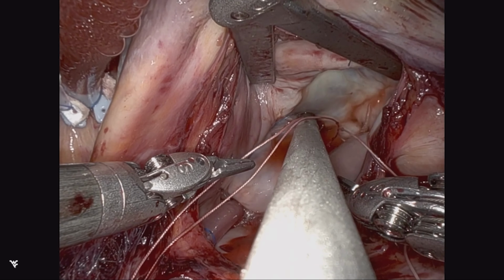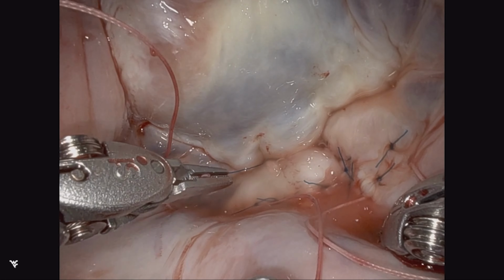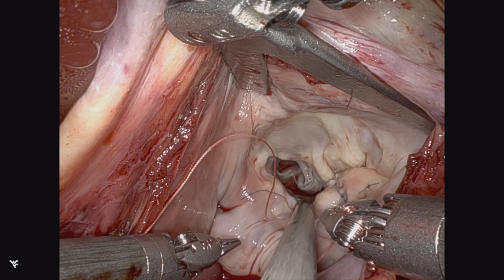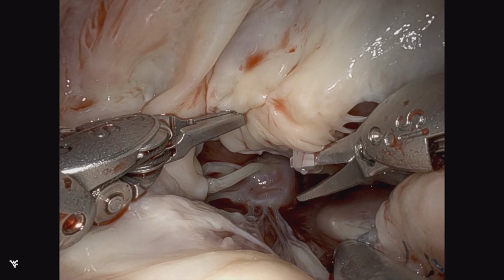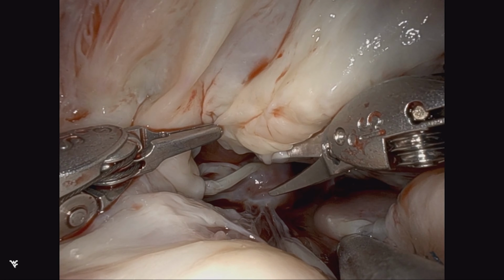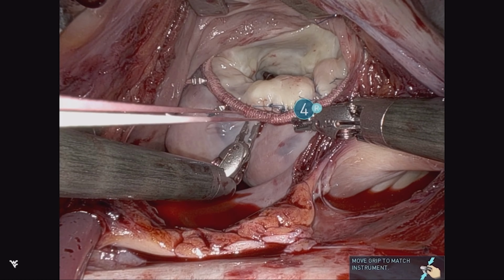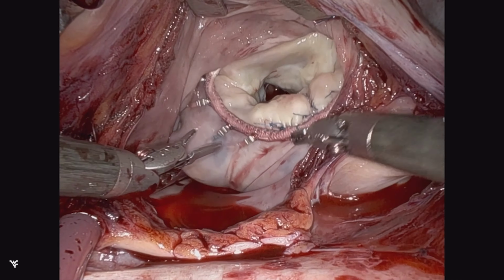And then a final test. And we can see that we've got good ratio of the anterior to posterior, the 2/3 to 1/3 ratio, and good depth of coaptation. And so at this juncture, we'll divide a couple of extra secondary chords just to further augment that coaptation, much like we've demonstrated previously, mainly at the restriction point, which you can visualize during testing. And then again, another 38 millimeter band to complete the repair.